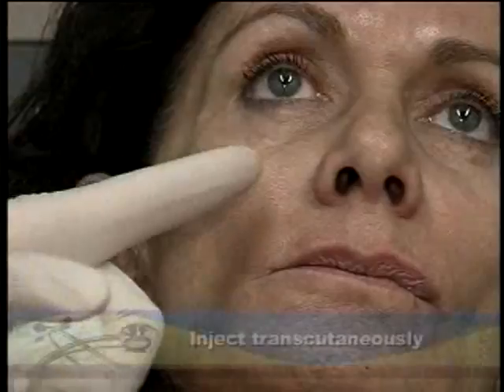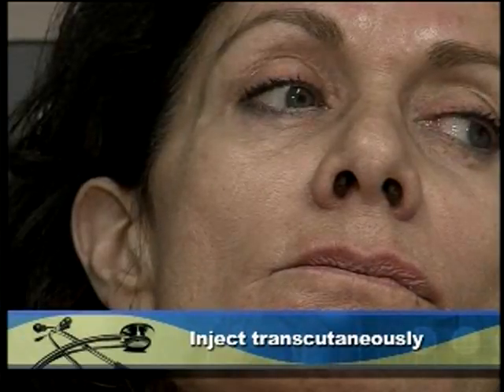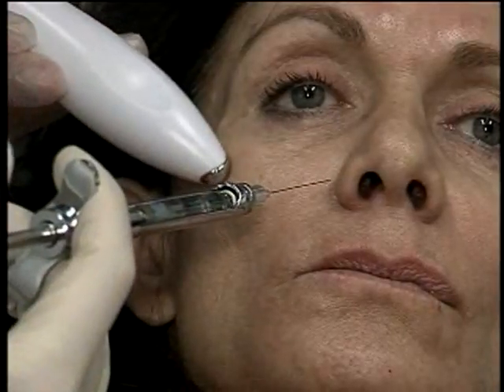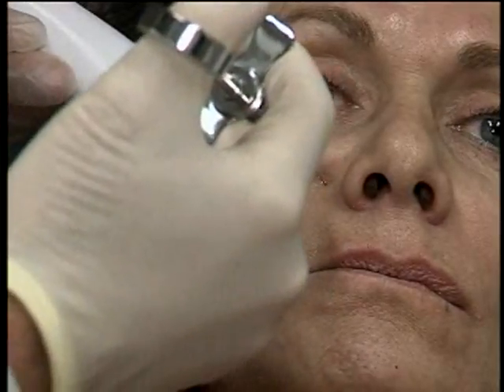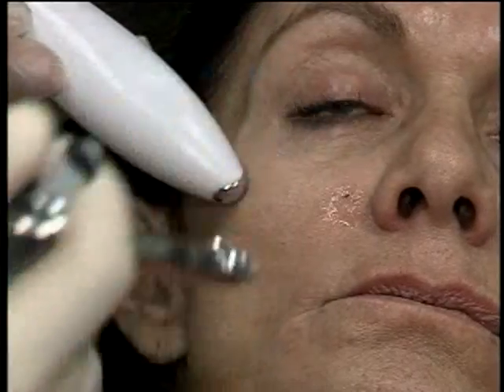Now an alternative method, in order to anesthetize the upper lip, I'm going to show you on this side, is to do a transcutaneous. And actually transcutaneous is a bit easier to do. So if you're just getting started with these nerve blocks and you're a little concerned about how to do them appropriately, you can go transcutaneous. What you do is, I look at where the triangle is of the nasolabial crease where it comes into the alar insertion. If you go just lateral, about 1 centimeter, and you inject down to the bone, and deposit a quarter cc, that'll work just as well too.